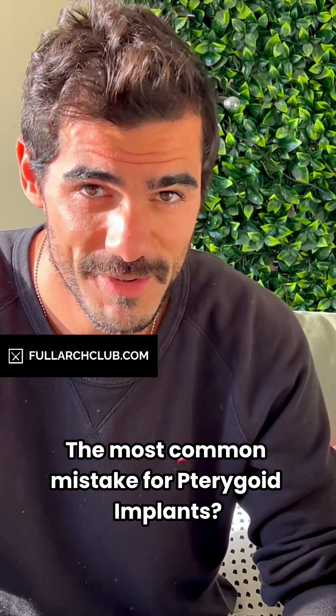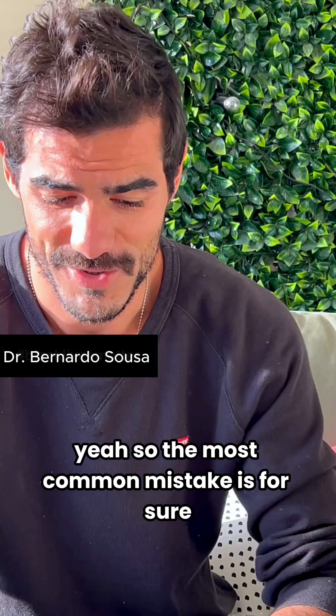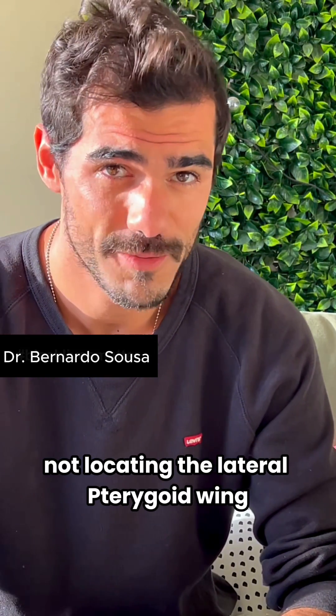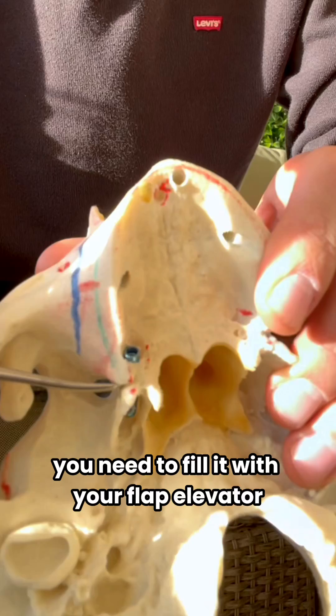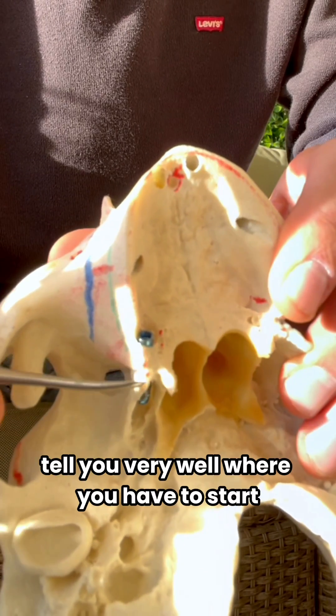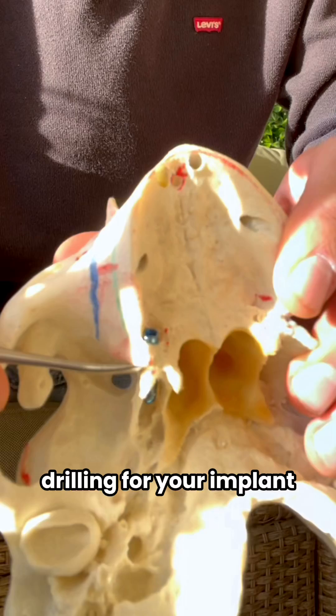The most common mistake for pterygoid implants is not locating the lateral pterygoid wing. You need to feel it with your flap elevator, because that will tell you very well where you have to start drilling for your implant.